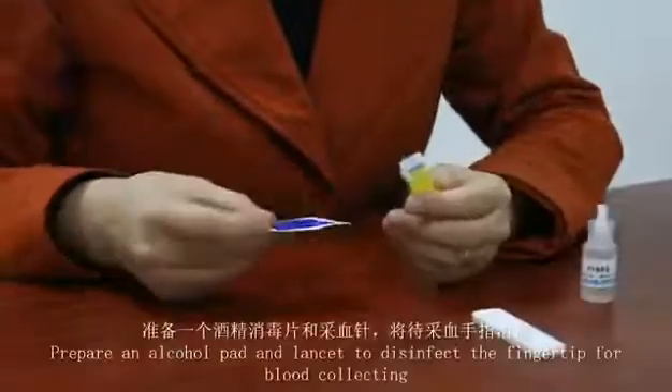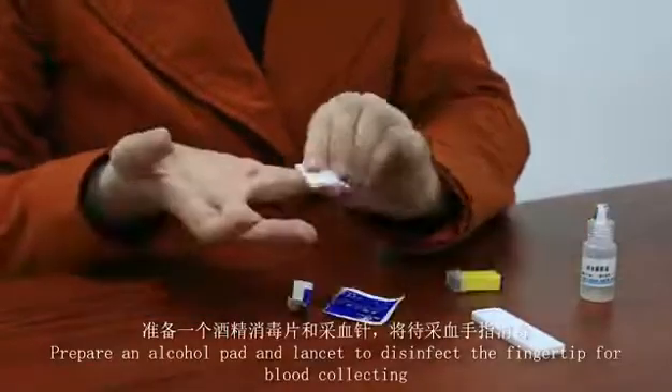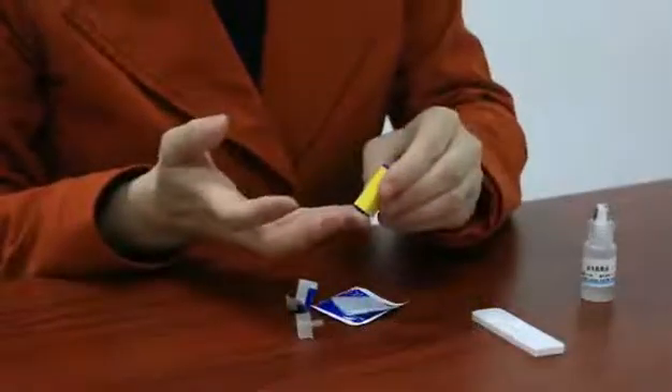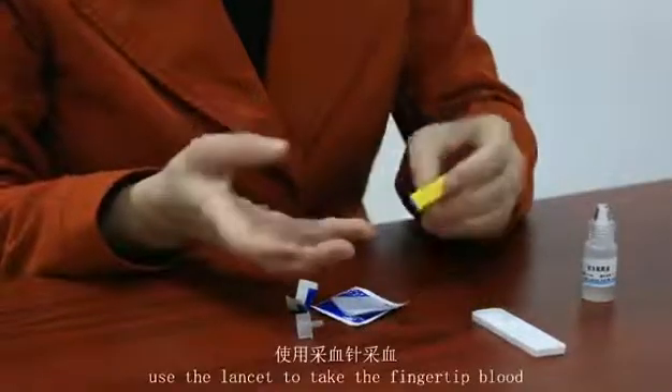Prepare an alcohol pad and lancet to disinfect the fingertip for blood collecting. Use the lancet to take the fingertip blood.